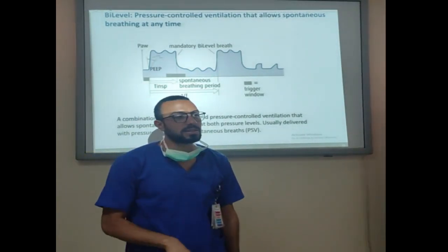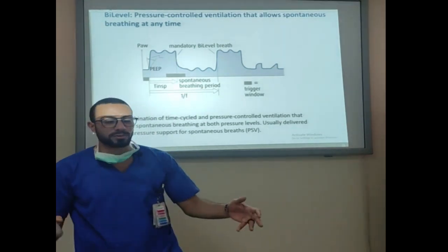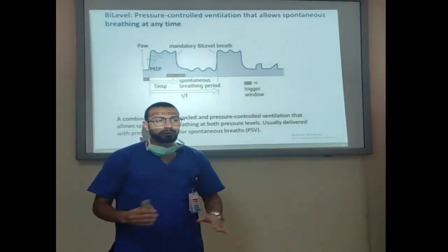Unlike the CPAP. CPAP totally depends on the patient. So CPAP is the mode of weaning. The mode of choice for weaning. Okay? Any question in the modes?